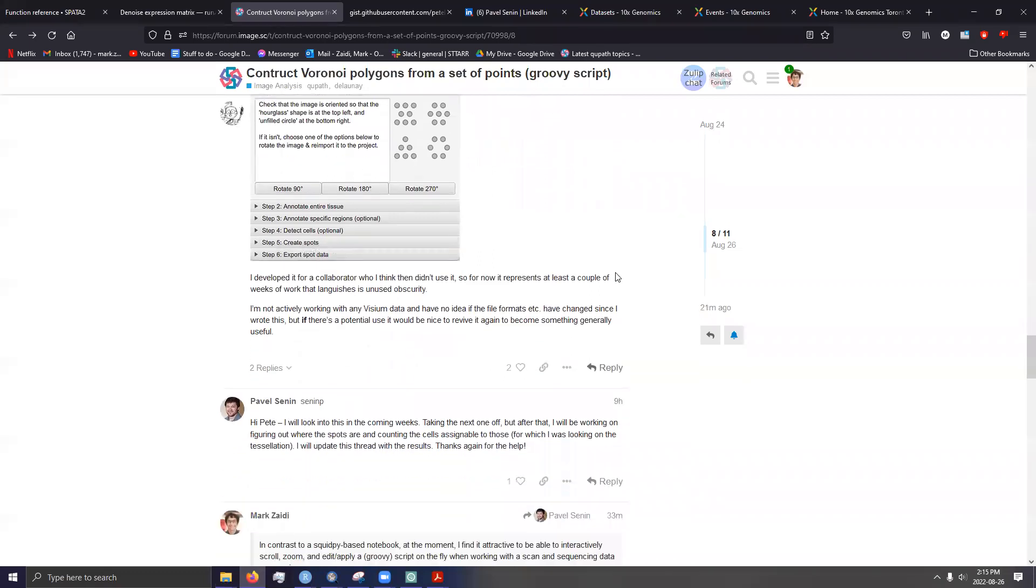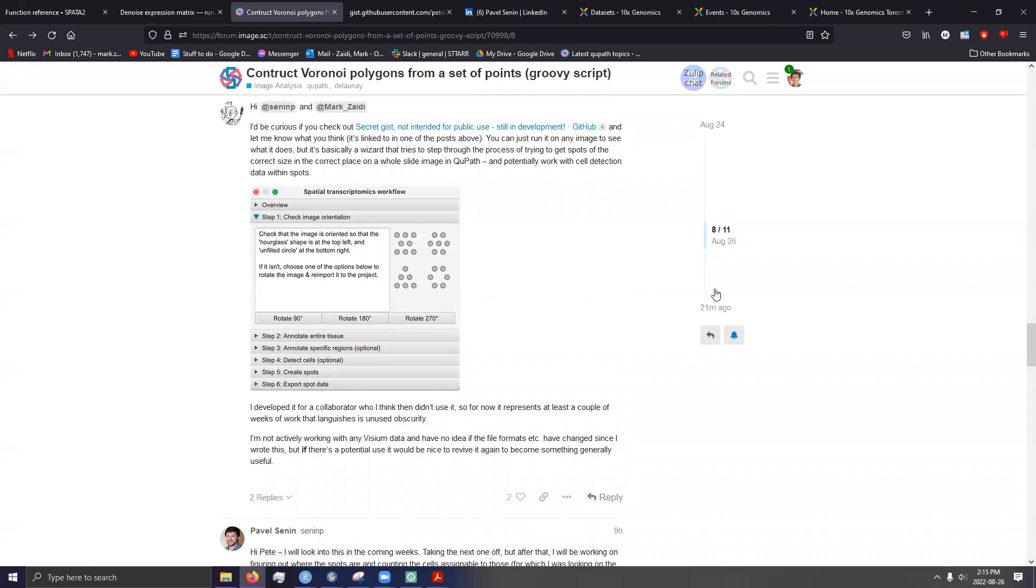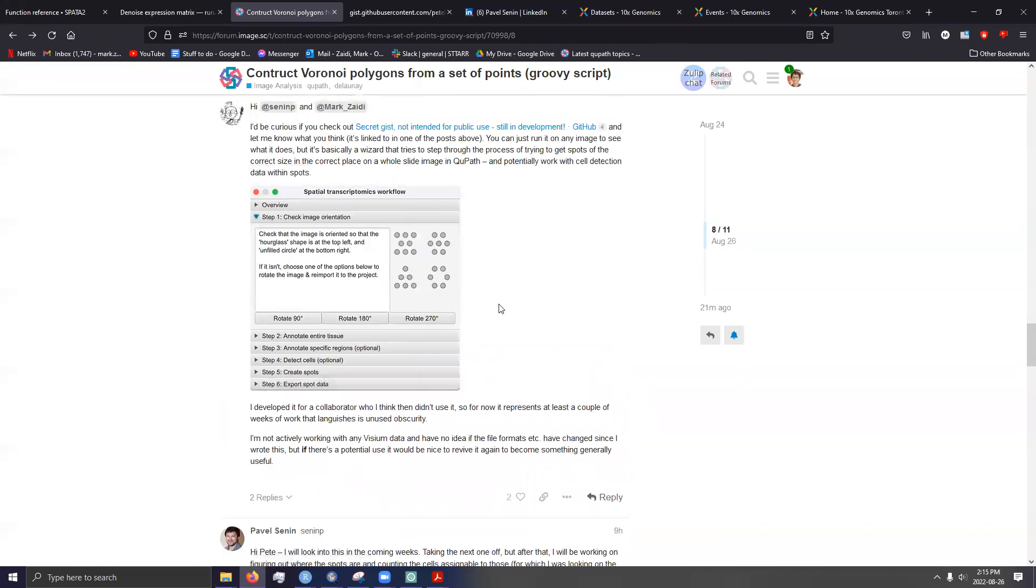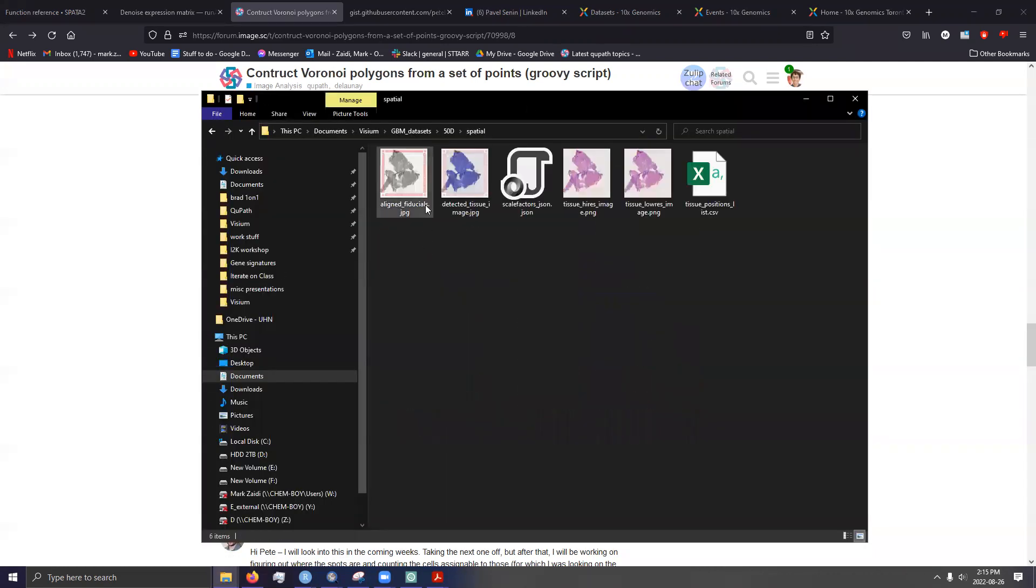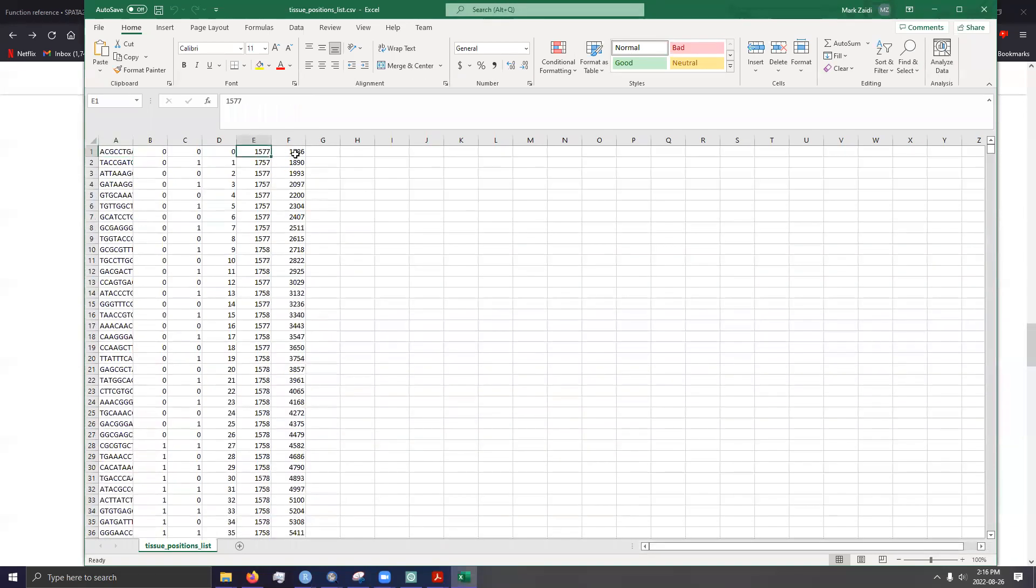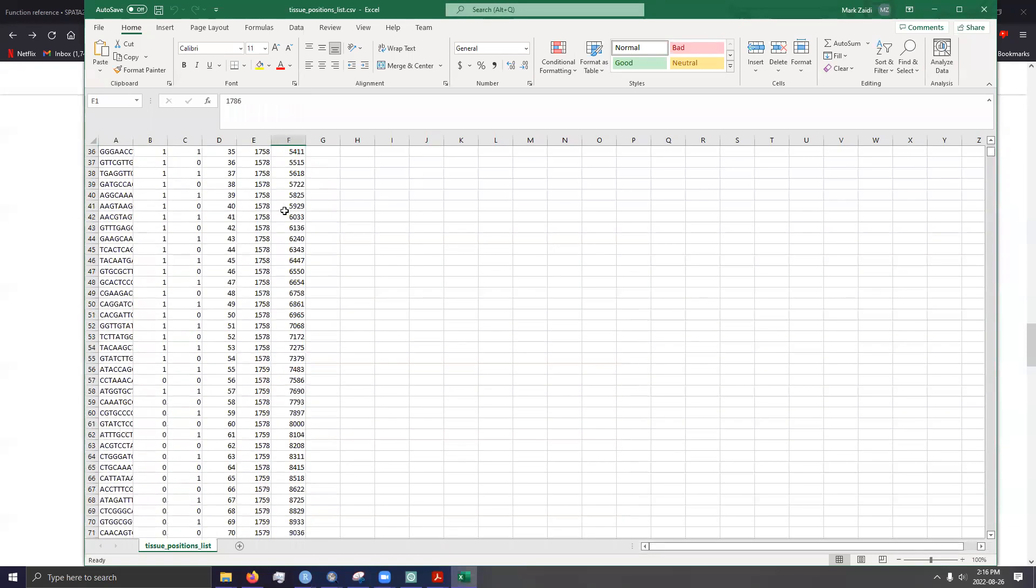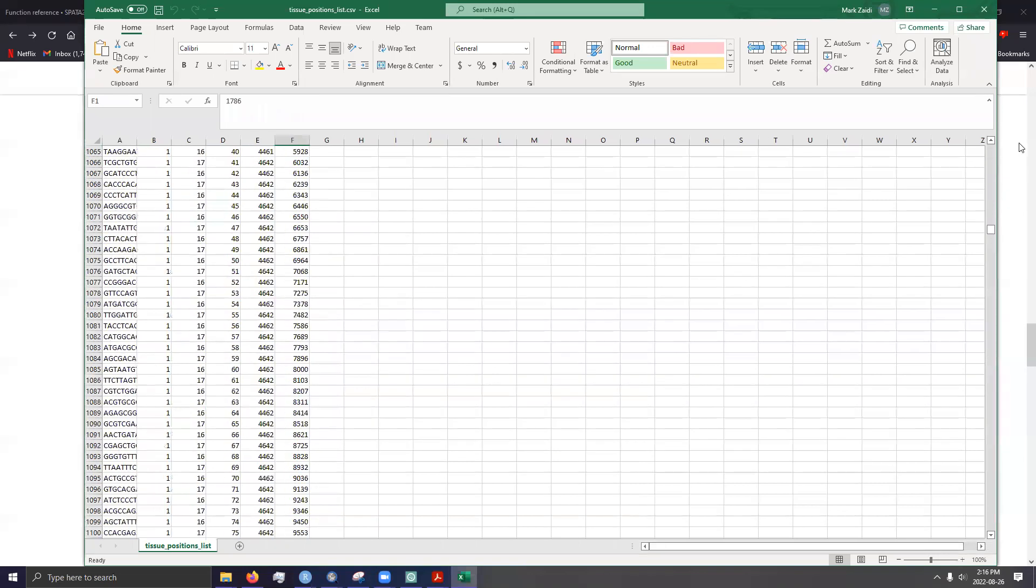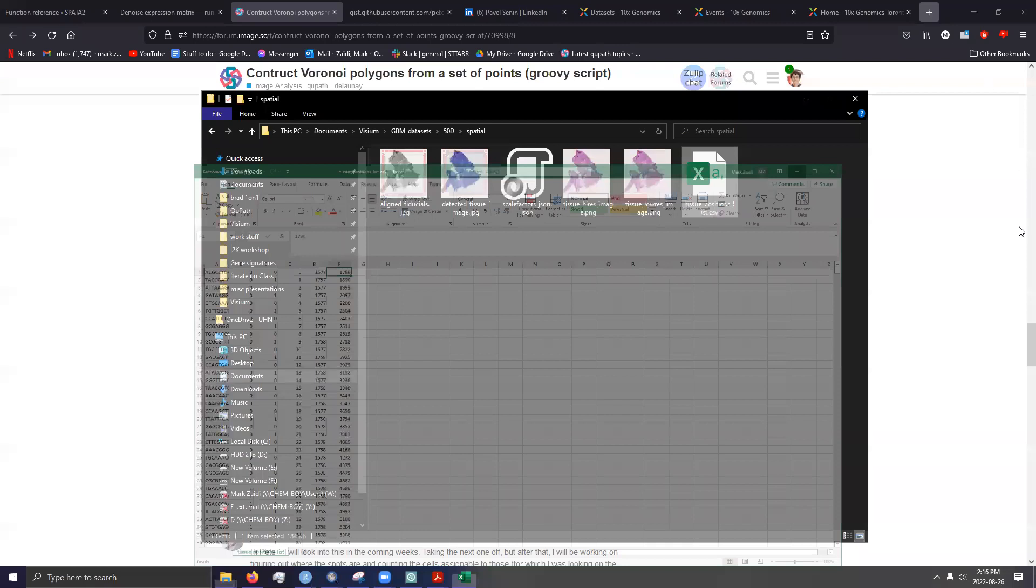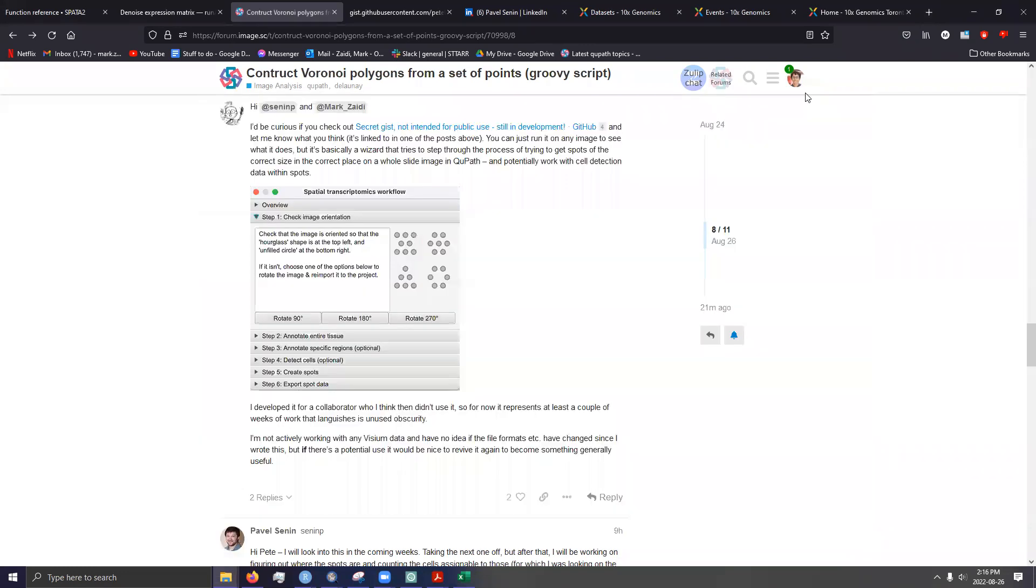Yeah. So that was one of the reasons, like if I tried loading in a whole slide image, which I had to request specifically from the core facility that processed these images, the actual coordinates that are stored in the coordinate file, I think it's called tissue position list. There's no information about what this number is. Is it microns? Is it pixels? Where's the point of origin? And if you use a completely different image with a completely different scale, those points are probably not going to line up.